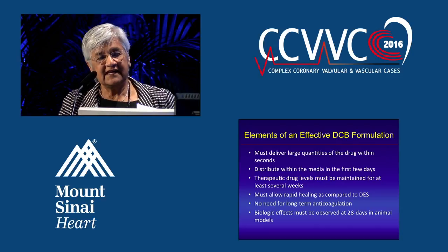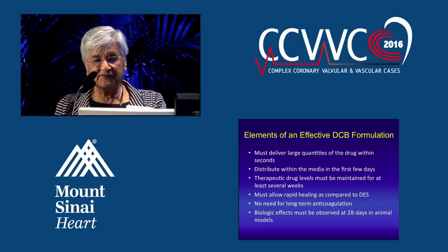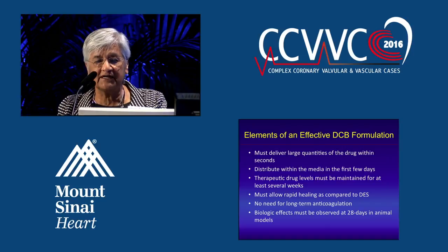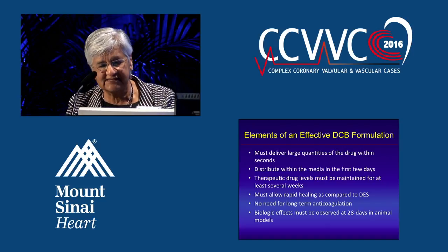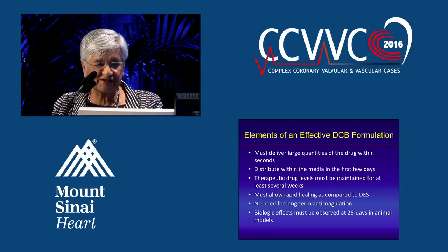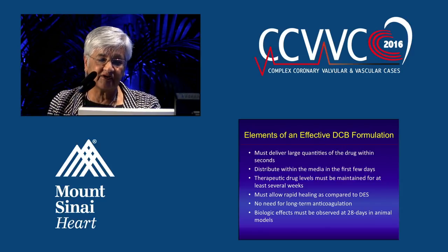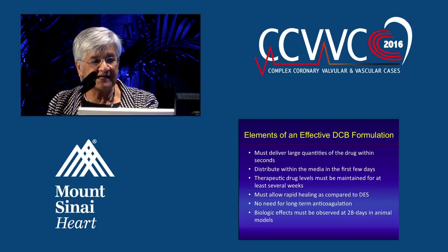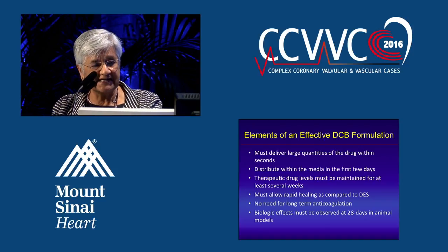The elements of effectiveness of drug-coated balloons: what do we need? I think we must deliver large quantities of drug within seconds. It must distribute within the media in the first few days. The therapeutic drug levels must be maintained for several weeks. As I showed you, it is essential to have the drug since cell proliferation occurs over a long time.